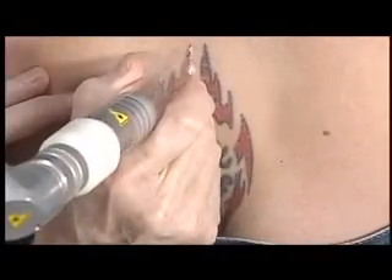The Revlite system is one of those almost do-it-all lasers. You can treat brown spots, things that are colored, and use it for improving the quality of skin. It can be used to treat acne and melasma. It's such a great adjunct to the cosmetic practice because it does so much.